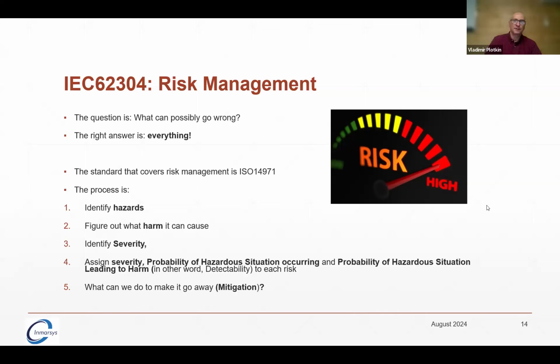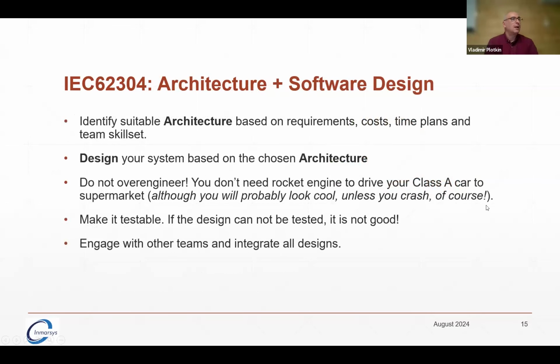So a device, most of the time, is detecting all sorts of potential problems. Then I think there is a question: is a defect considered a risk? It depends. It depends if it's really a risk. So it depends what kind of defect. It can be producing risk.